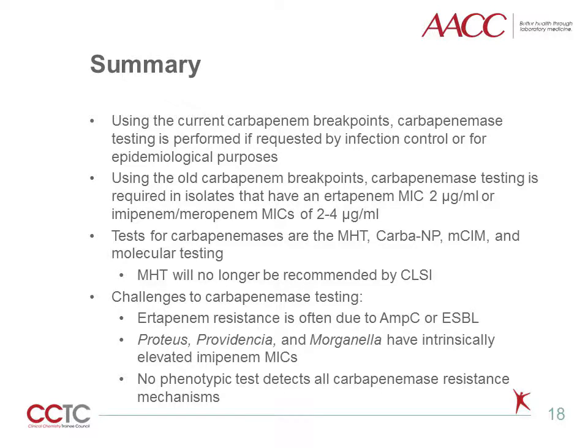Challenges to carbapenemase testing are that ertapenem resistance is often due to AmpC or ESBL. Proteus, Providencia, and Morganella have intrinsically elevated imipenem MICs, and no phenotypic test detects all carbapenemase resistance mechanisms.